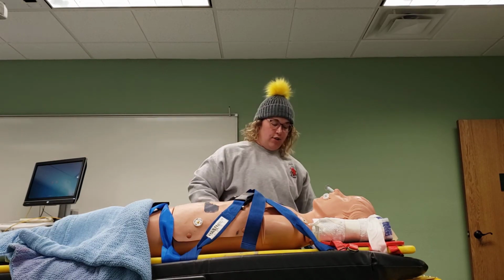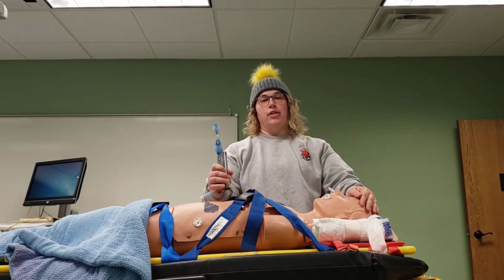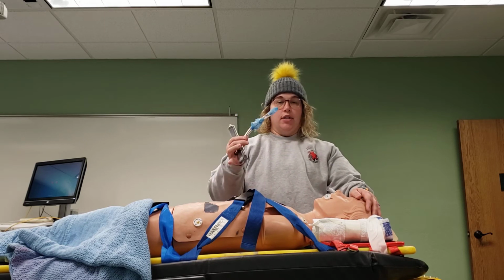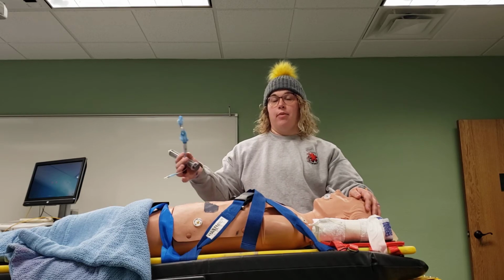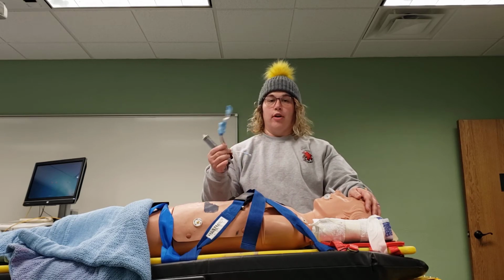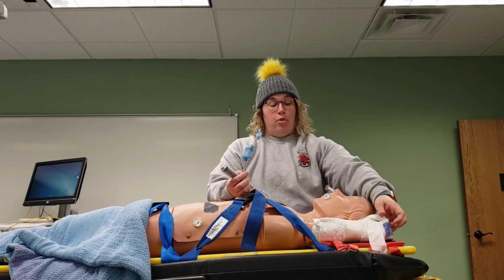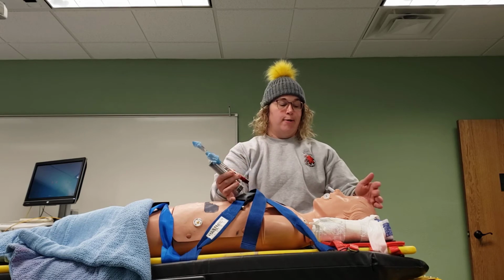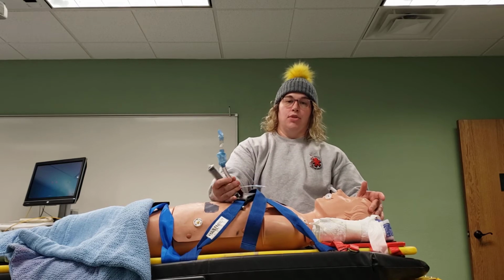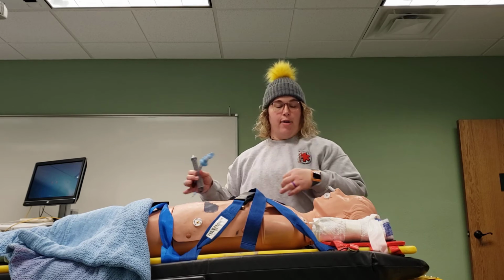Finally, for our advanced students, we are going to eventually be able to put an advanced airway in. Now, we know that science tells us that this no longer is as important as the rest of the stuff. So if this is going to inhibit your ability to do compressions or to shock the patient, then we don't do it. But if you have the time and you're able to do it, or enough providers, then certainly get an airway down. And this actually would be the airway of choice for pre-hospital, the blind insertion airway device. Paramedics will still intubate, but we're finding that those intubation attempts delay other things that need to be happening. So we're trying to push away the focus of attempting to intubate.